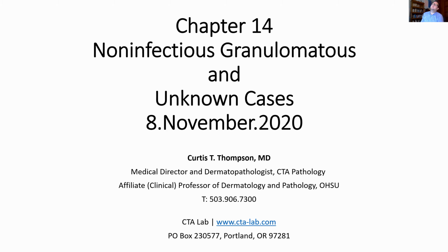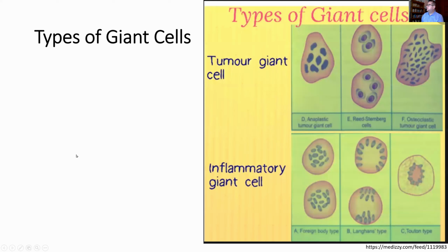I've seen over my career, this kind of became an entity, then became a pattern. And I think it's best to view it as an inflammatory pattern. And one concept, which I'm going to repeat again, is neutrophilic infiltrate, which we can also call suppurative. So when you say the word suppurative and granulomatous at the same time, you should immediately think of an infectious process. This is palisaded, so it's a little bit different, but we're going to look at a lot of palisaded entities today.